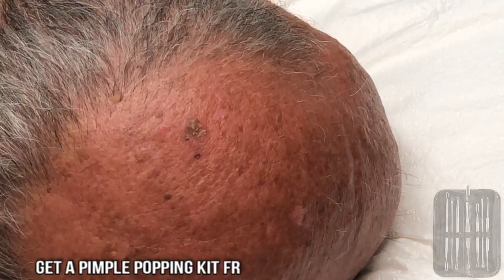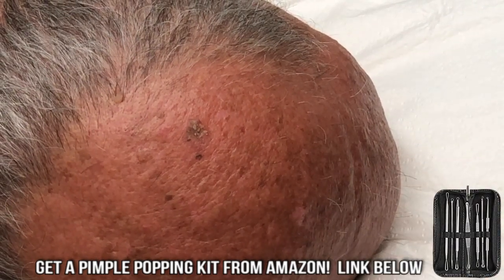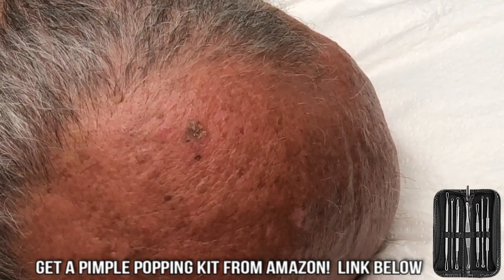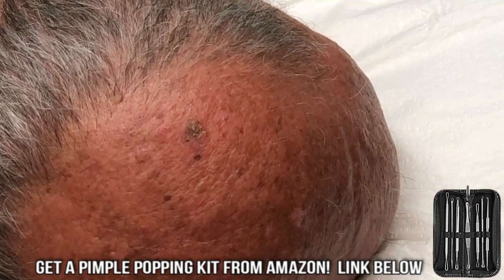We have to go through two complete freeze-thaw cycles to get complete desiccation of the lesion. Then we'll take care of your dilated pore of Winer on your back. That's what that little bump is called. Now, you've got lots of little bumps, but we're taking care of the ones that you have requested that we take off.